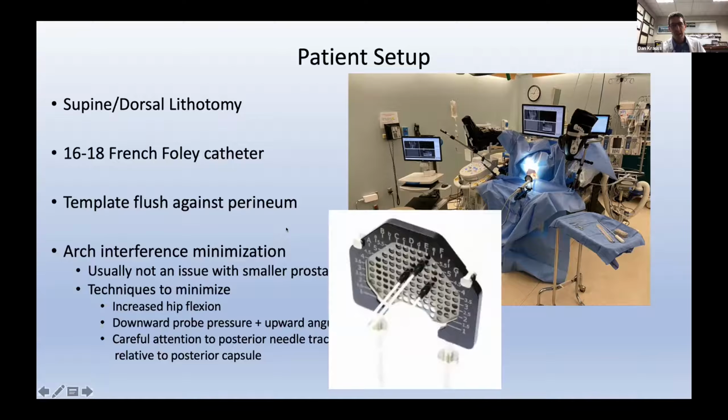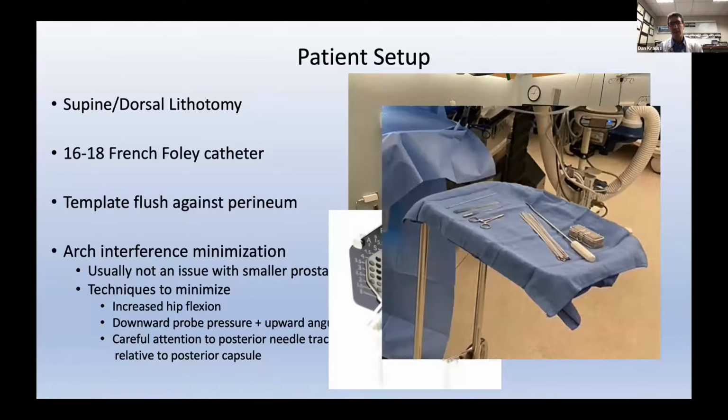We use, of course, because it's Beaumont, the Elekta Martinez interstitial template, which you can see here. This largely mimics the custom in-house equipment that we used here for many, many years. Here's a close-up of our Mayo stand with really all of the equipment that we need. You can see here the wrench that we use to tighten the collets. This little basket here holds all of the collets that are placed in the template positions.